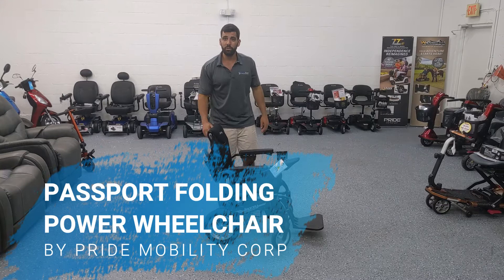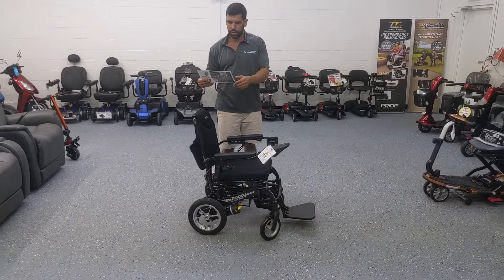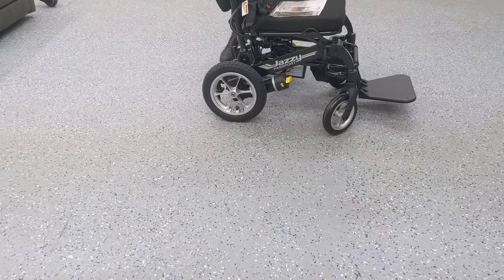Hi everybody, I'm Sergio with Mobility Scooters Direct, here today to do a review video of the Pride Mobility Jazzy Passport folding power wheelchair. This is model FJPT 1700 and this model holds up to 250 pounds.